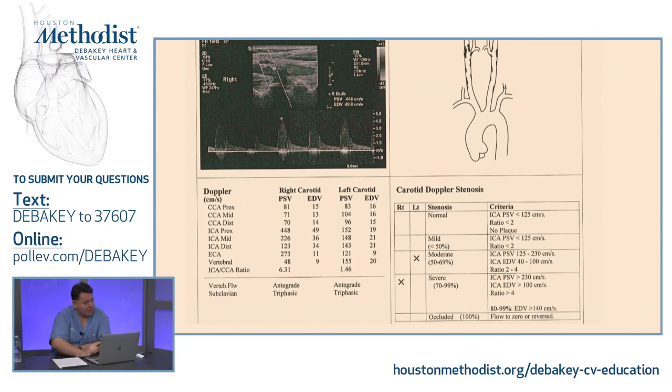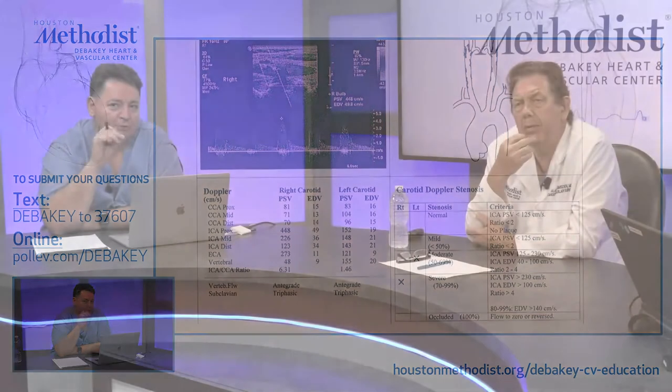So does this auto-populate the report on the right, or do you? On the left, yeah. And the right is a sonographer providing me a prelim, or we have a fellow or residents doing a prelim, and on the form, they are clicking those X's.